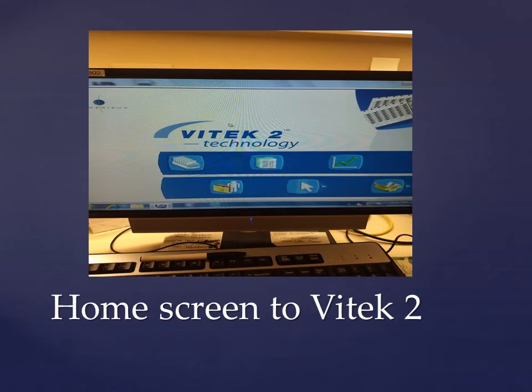This is the home screen for the Vitek 2. What you're going to do is make your McFarland standard, and treat it just like you would a patient. You're going to put it in the rack, pipette over the appropriate amount into the second 3 ml tube, and load it onto the machine. Then we're going to come to the computer and select the icon that looks like a rack with a bunch of cards in it.